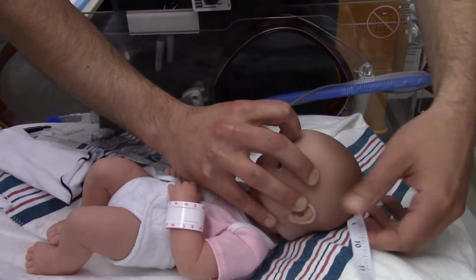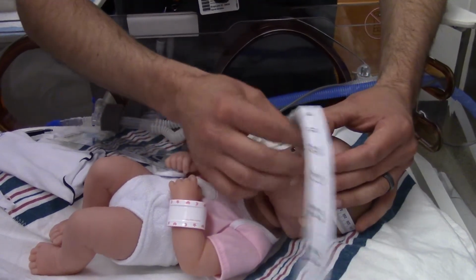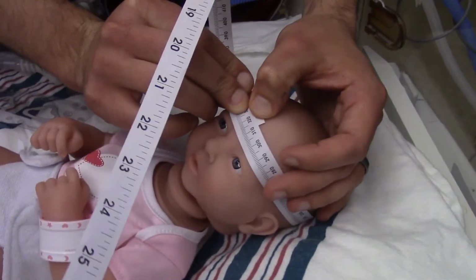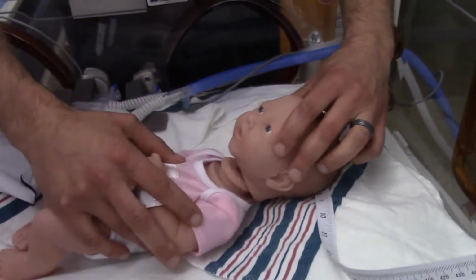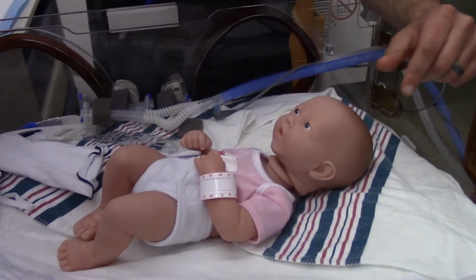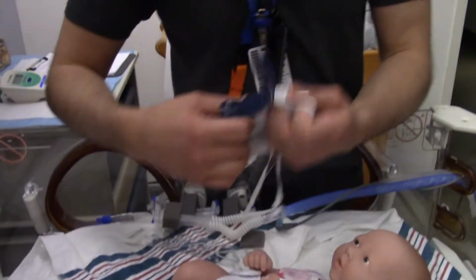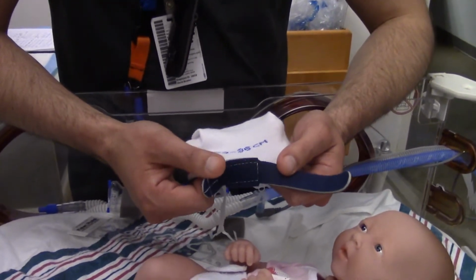And we want to measure at the thickest part. Come over and we can see that the baby's OFC is about 31. Excuse this baby, she's not the most pliable, so if it looks like the baby's head is a little loose, it wasn't me, it was the cheap baby. So we have 31.